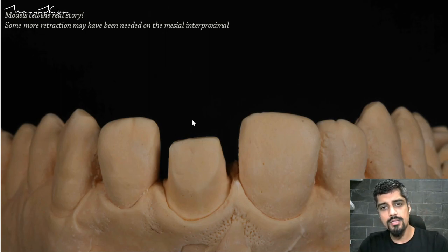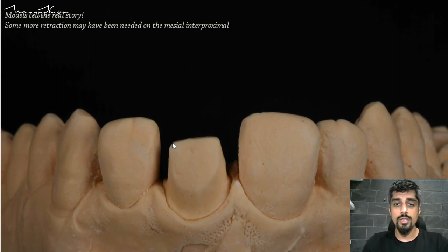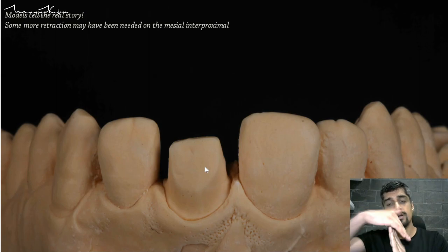This is the model that comes from the impression that my technician pours. You do not have to pour your impression — you are never going to be as good as your technician. When you look at the model, you should read your models when they come back from the lab — you will learn a lot about your mistakes. In this model you can really appreciate the two-plane reduction of the central incisor.